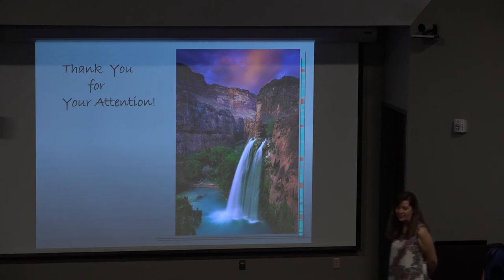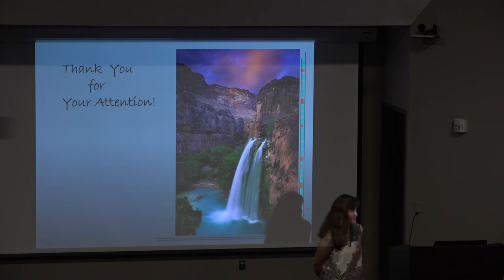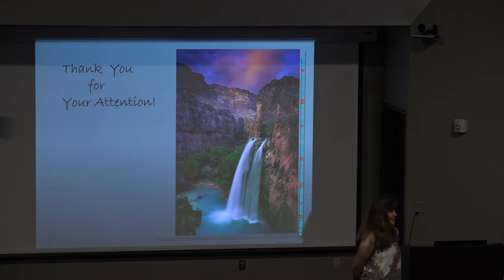We did this, at least in the research protocol, but I was a subject in that study. The way it worked was you get the MRI first, and then the MRI images were projected onto a screen. They would live scan you with ultrasound and project the ultrasound images onto the MRI at the same time, and it was all recorded so that you could integrate exactly what you're seeing on the MRI with what's going on in the ultrasound.